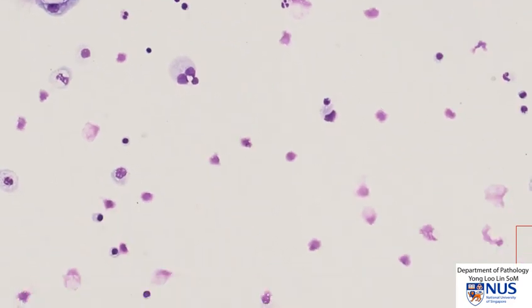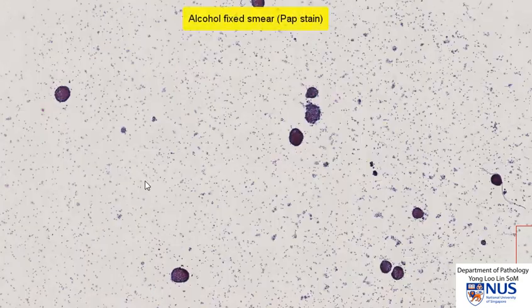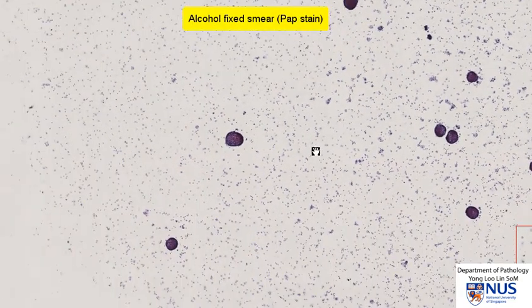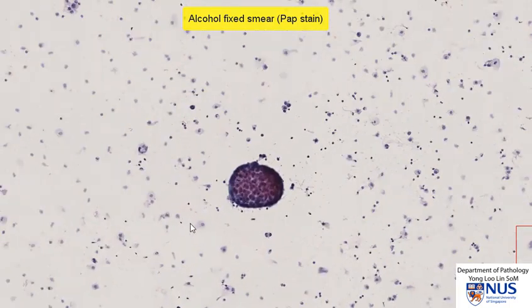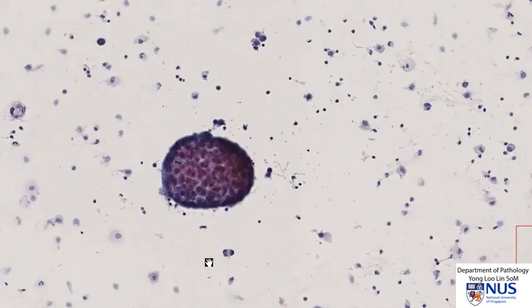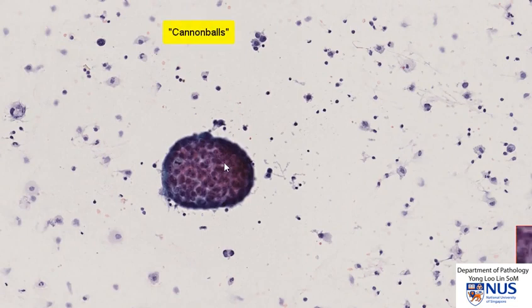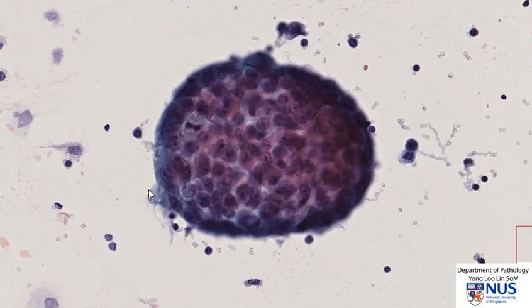Let's have a look at the alcohol-fixed smear. A similar pattern is seen with these very, very rounded cell clusters. Sometimes these are also known as cannonball cell clusters because of the smooth outlines and the rounded shape. We can actually appreciate a mitotic figure here.